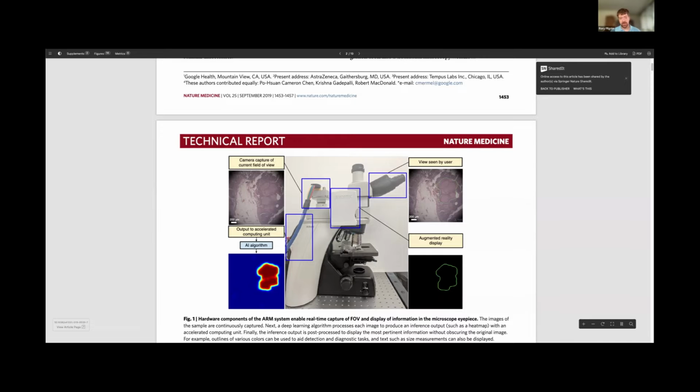The way it works is that it is an embeddings model. What that means is that if you send this tool a patch from a whole slide image, an H&E slide, it is able to understand the core features ensconced in that patch and then produce a very structured piece of data that we call an embedding. This is just a vector, a set number of numbers, and that can be used by a subsequent model to understand key features.